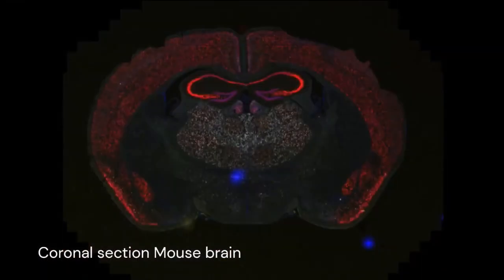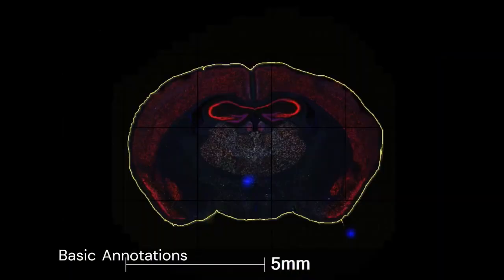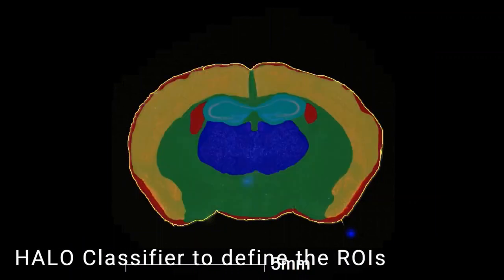Now, showing you a brief video, we are looking at the coronal section of the mouse brain. I would like to walk you through the basic workflow of HALO. These are the basic annotations. Here we are using a classifier to define the ROIs to be analyzed. The analysis is initiated and in progress.